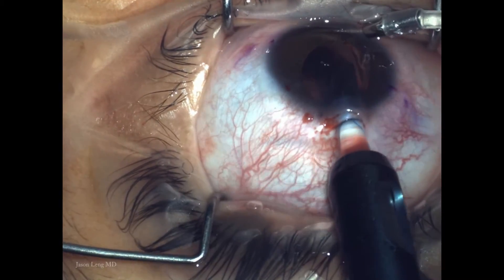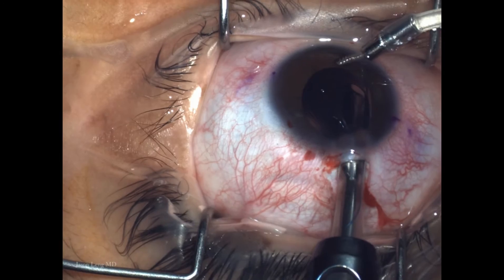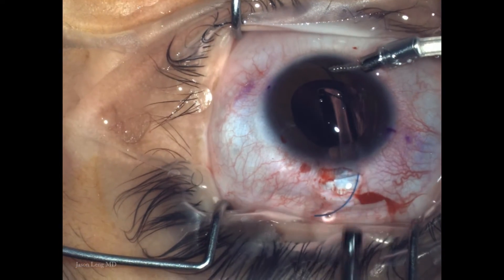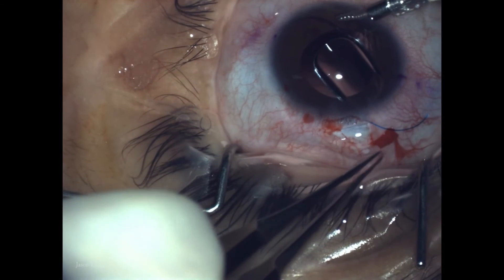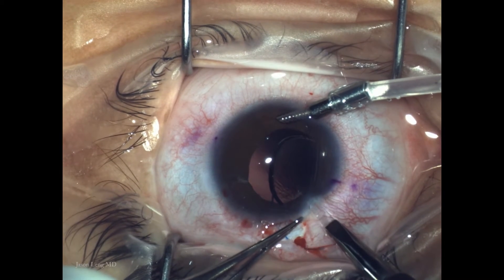Here I'm injecting an AMO Tecnis ZB9003 lens, a standard three-piece lens that I use in most of my cases. I put the leading haptic on top of the iris.